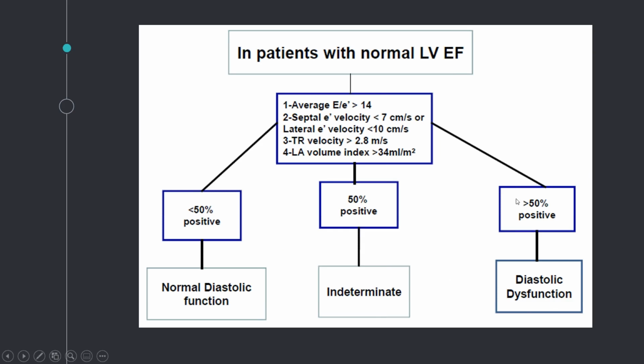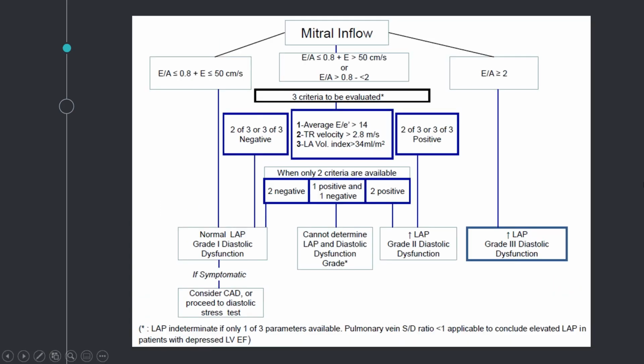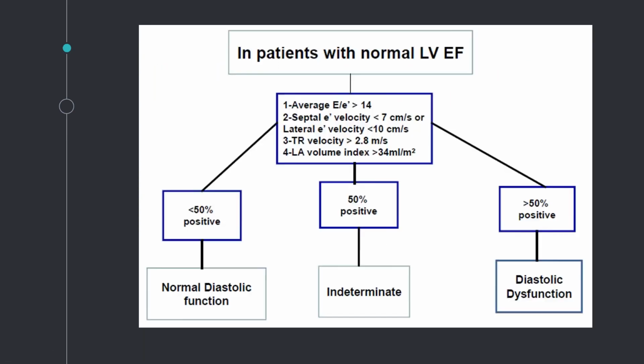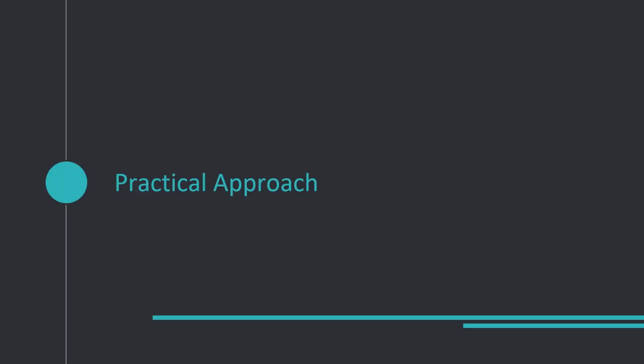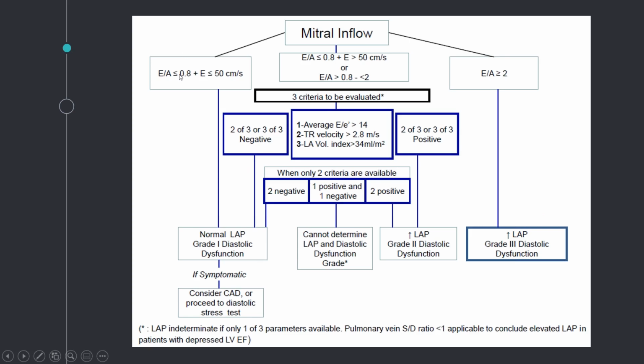Now, if you have diastolic dysfunction because you satisfy a lot of these criteria, then you can classify what kind of diastolic dysfunction you have based on, before you were looking at mostly E prime and E over E prime. Then your next step would be looking at E over A. If you remember, E over A mostly looks at the mitral inflow signal, comparing the E wave and the A wave. And going back here, I don't know if you can see my mouse, it's basically looking at the top row. What's the relationship between E wave and the A wave is basically what it's talking about, because you can flip back and forth and have different numbers based on the degree of diastolic dysfunction, as I explained earlier.